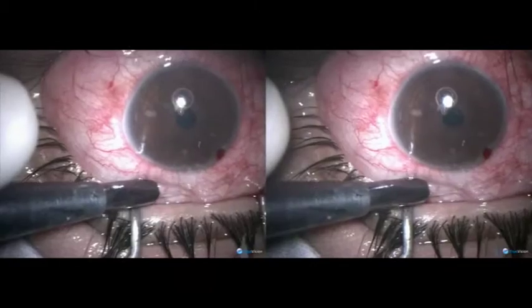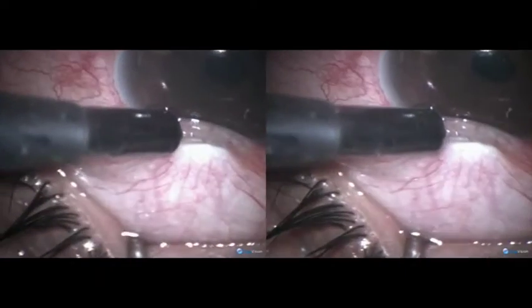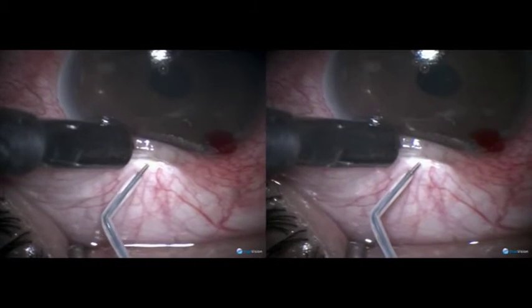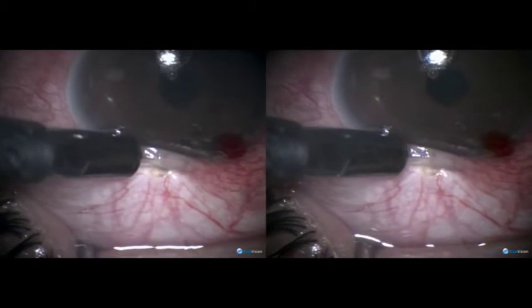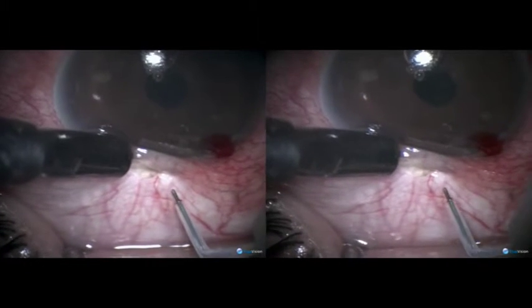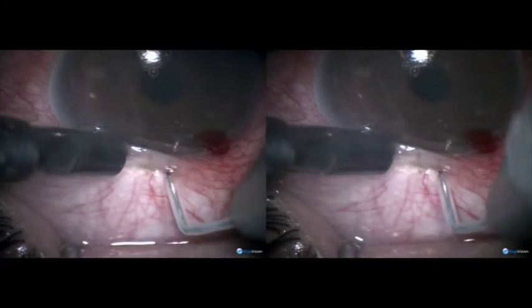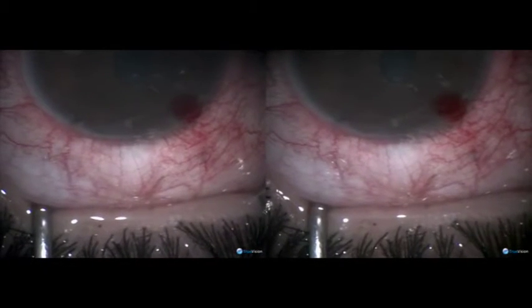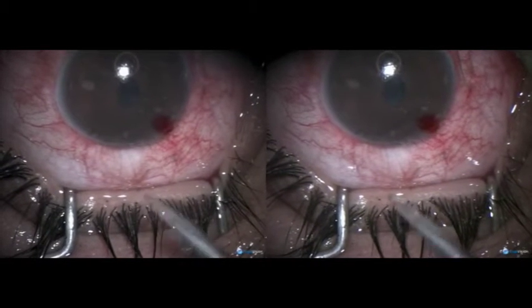When you fill the anterior chamber with helon, the aqueous doesn't leak on microtrack filtration. Notice carefully — the tip is being introduced at an angle from the left and then from the right. The idea is that the tracks should converge anteriorly and diverge posteriorly. So we have to do an iridectomy.